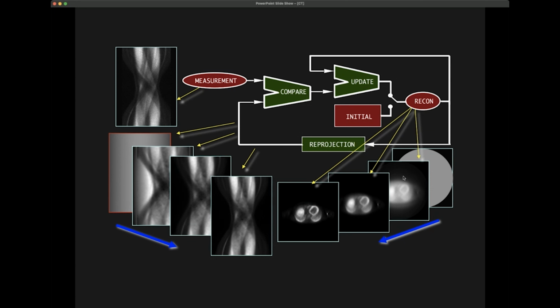And that's actually being expressed here. So we have the measurement, that's our sinogram. So this is what we measured with a real scanner. So what we do is we say first, okay, we don't know anything about the body that's being worked out. So let's say that the distribution is just a circle of attenuation coefficients everywhere. Say that it was homogeneous. So we say here that the real distribution would be this kind of gray circle of distribution.